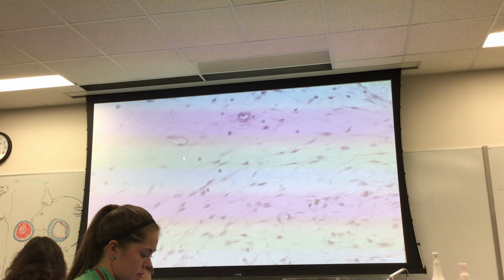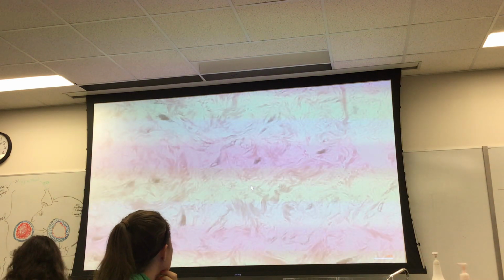Now, let's contrast that with this, which has certainly a similar appearance. Now here's the same egg we just looked at. See the difference? You have to train your eye to this, but the cells more or less look the same as the previous image, but now we're picking up this collagen.